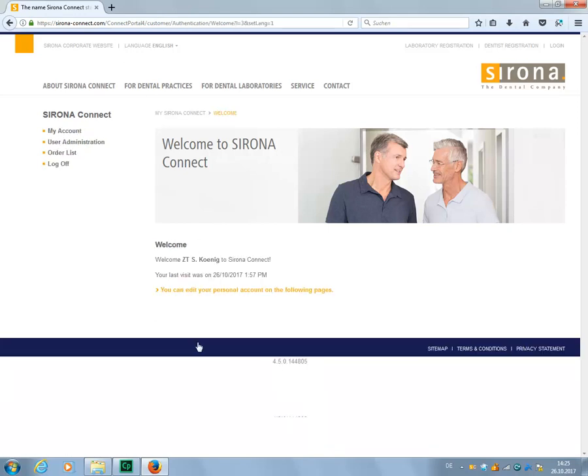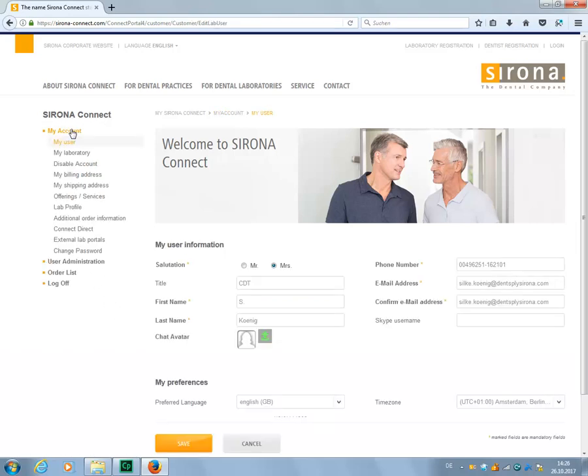First, your start screen opens where you can access various areas. You will find your lab profile as well as additional order information under My Account. Here you will find several submenus which you can edit when you log in for the first time and adapt at any time thereafter.